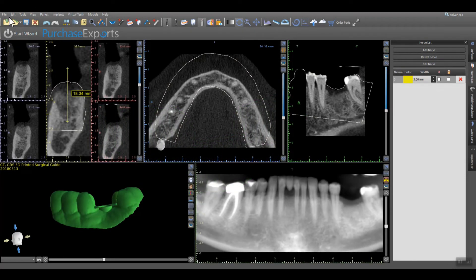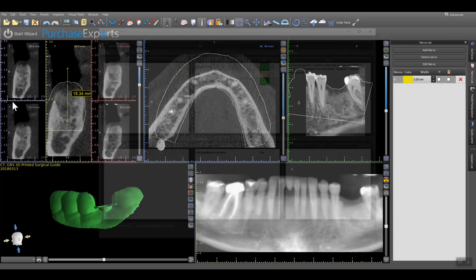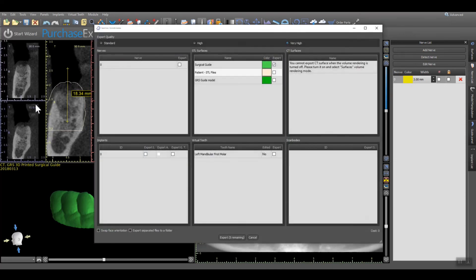After verifying that the surgical guide design meets all surgical requirements and can now be 3D printed, simply go to the upper left of the screen and under the File menu, click on Export Data. The Export Data screen will appear in which to select all of the various items that can be exported for 3D printing. Most often, the only item to be 3D printed is the surgical guide.